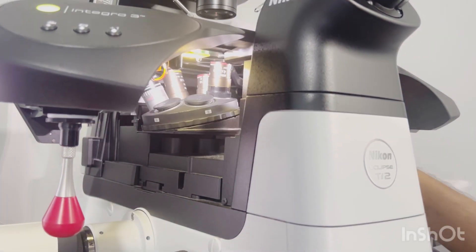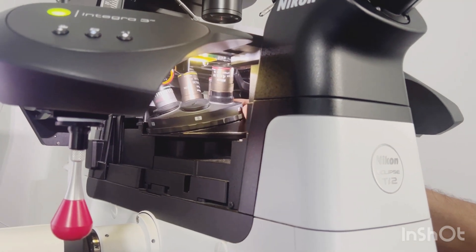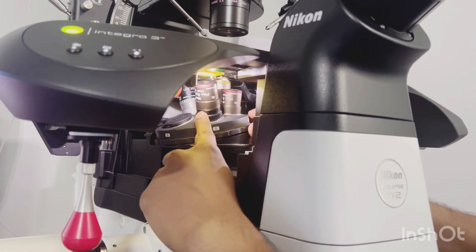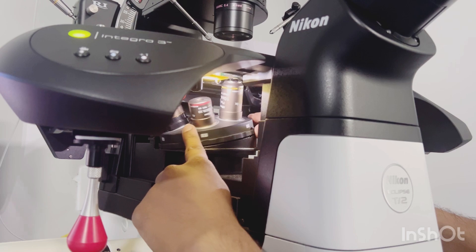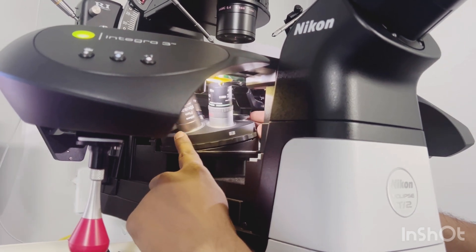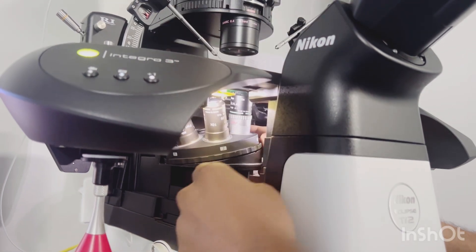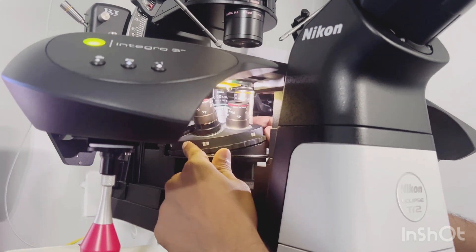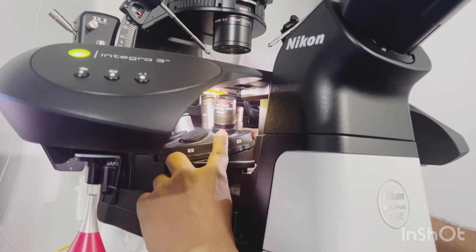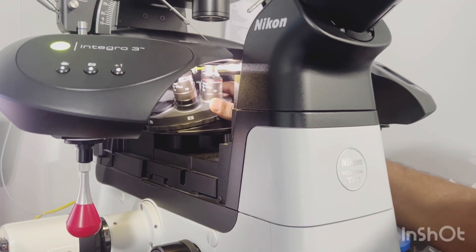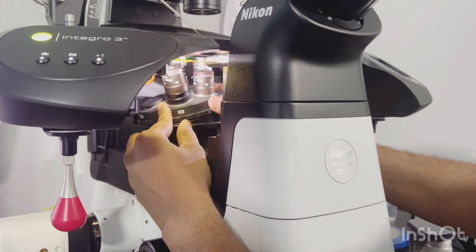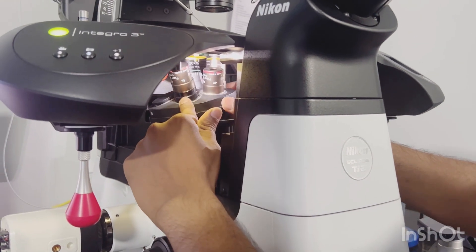Basically, we have four objectives: first one is 4x, next one is again 4x, then 10x, and 20x. When our lever is at the upside position, we have to arrange our microscope at this long 4x objective for initial alignment.